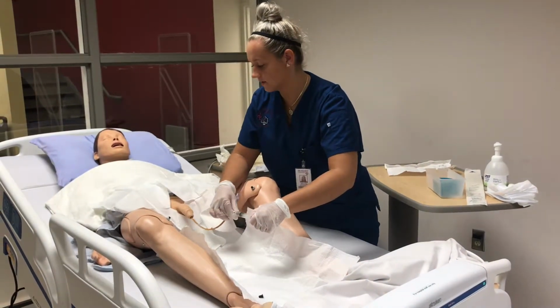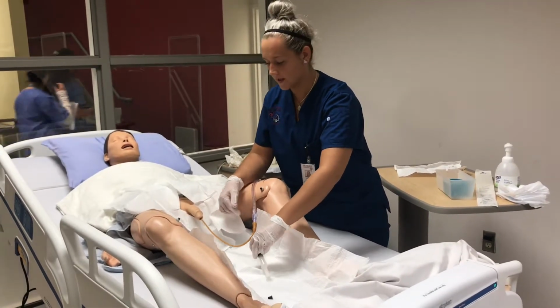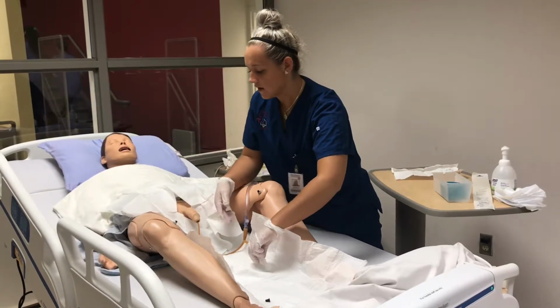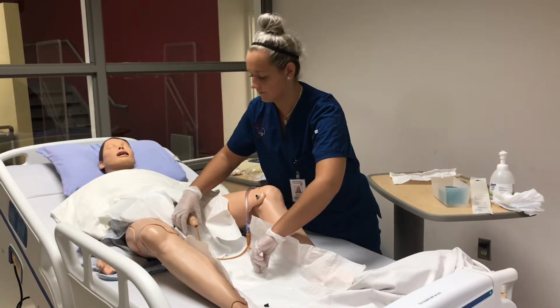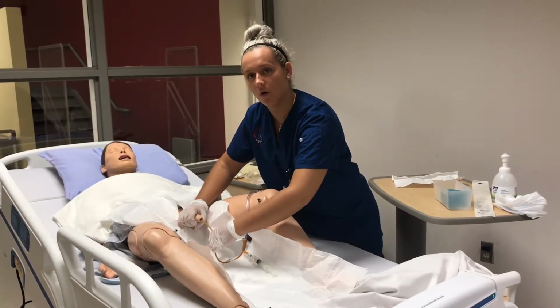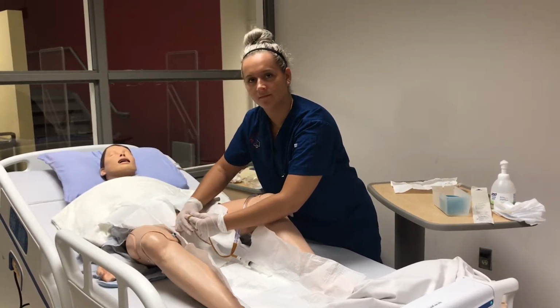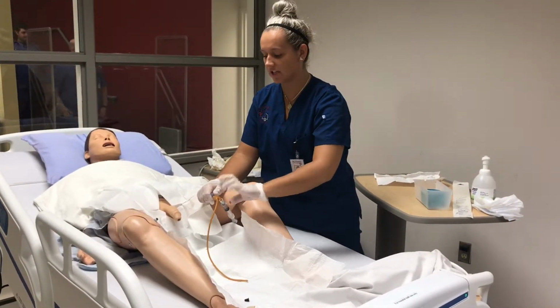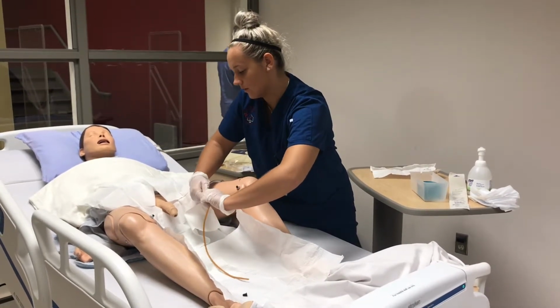Once that is done, I can now slowly pull out the catheter, and I need to be cautious if the patient is feeling any pain. While doing this, I grab the shaft of the penis and slowly coil the catheter around my finger. Okay, so now I'm going to detach the catheter from the urinary bag. By doing this, you just pull it off.